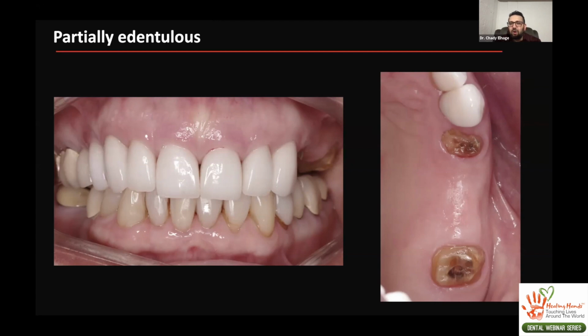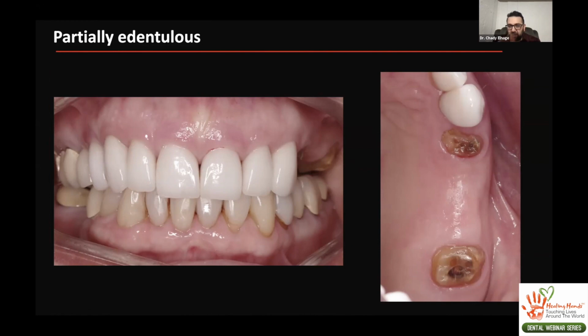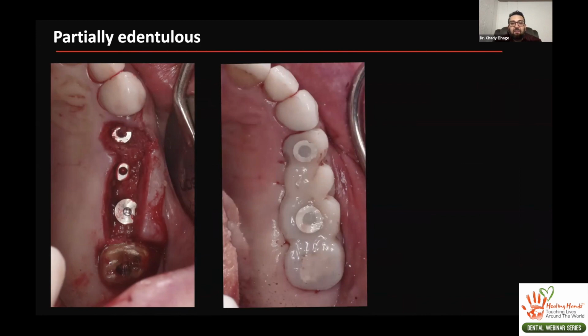This was a unique case because, as you can see, this was an old bridge from bicuspid to molar that fractured off at the gum line. So we took it upon ourselves to put in some immediate implants and load them, mainly because, as you can see here, we only immediately placed the implant in the bicuspid area. The other two implants are placed in fresh bone, bone where obviously teeth were removed years ago. It was very good bone. We kept the back tooth as well, since it was restorable. And what we did was we made a restoration that fit in place on both implants and on the natural tooth at the same time.